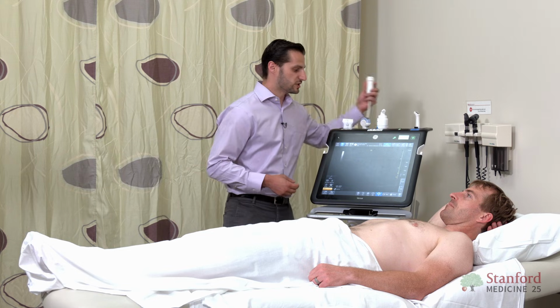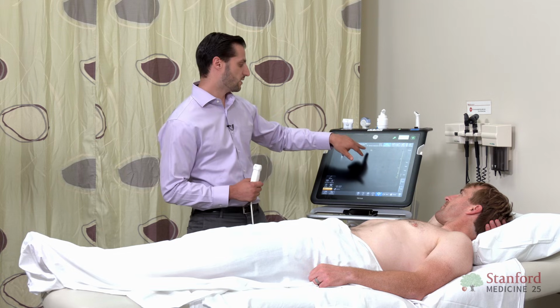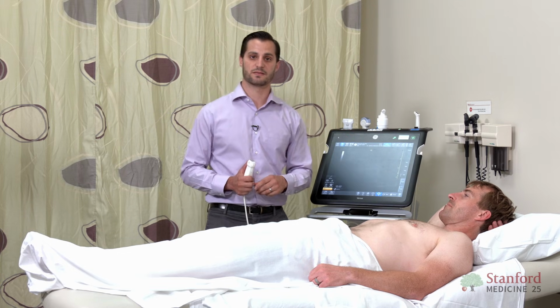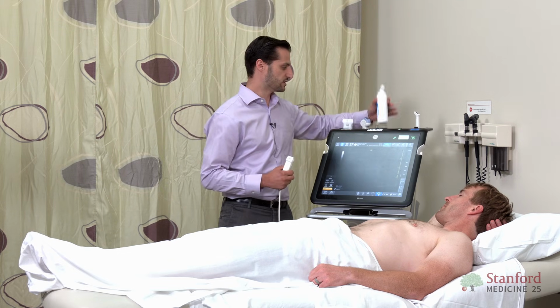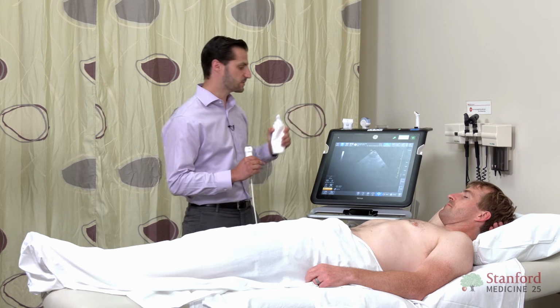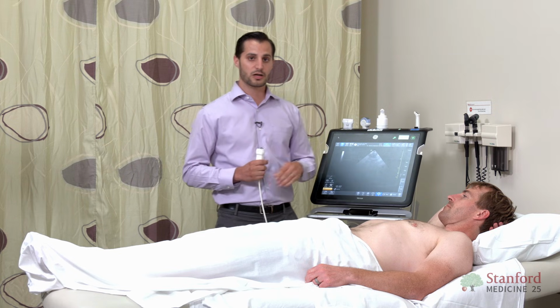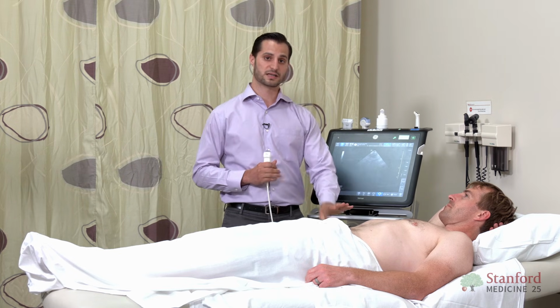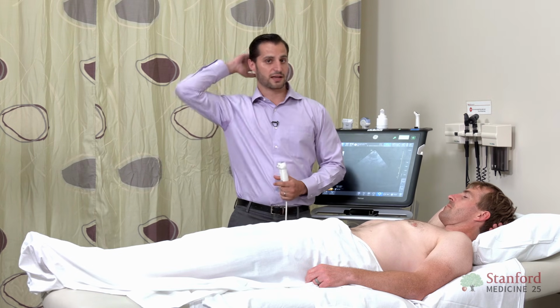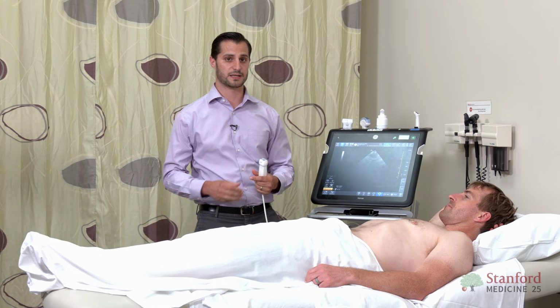You'll want to set your machine to abdominal mode, which allows for optimal image depth, gain, and frame rate. By convention, the dot on the screen is on the left side of the screen. Going to get my gel. If you have a patient, have them lie completely flat in bed. If it's a hospital bed, try to lower the head of the bed so they're completely flat. You want them to also have their hand pointed directly behind their head. This opens up the rib spaces and allows for much easier visualization of the kidney.